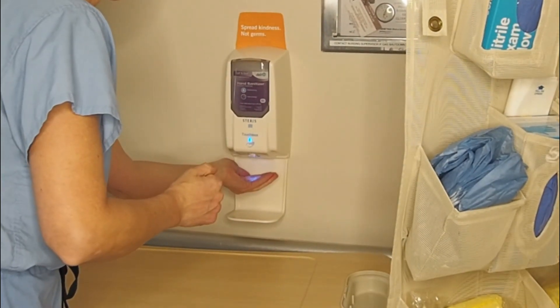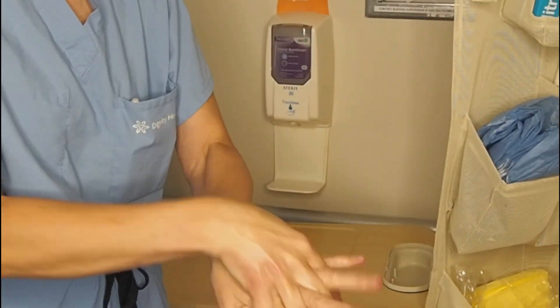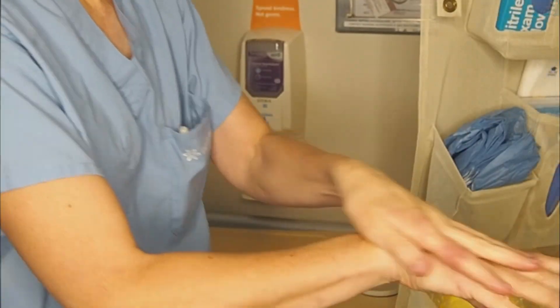All patient encounters should start with effective hand washing or alcohol use. Go between your fingers, around the backs of your hands, your wrists, and your thumbs.